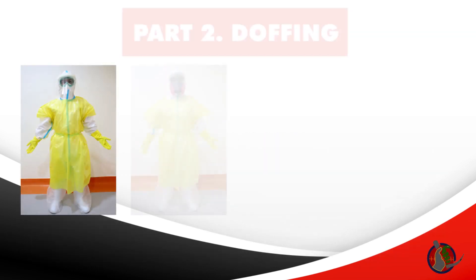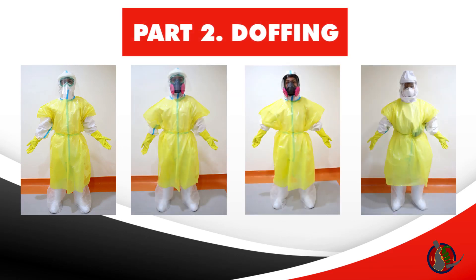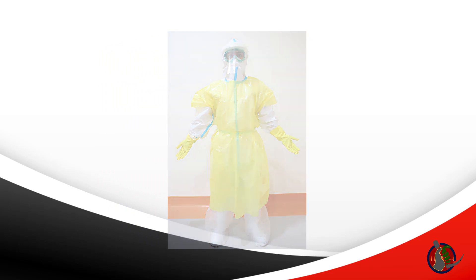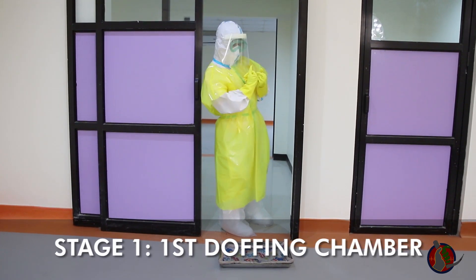Doffing is done after exposure to patients. All steps are done slowly and gently to avoid aerosolization of virus particles and contamination of oneself. Doffing is done in three stages. The first stage of doffing is done while inside the first doffing chamber.